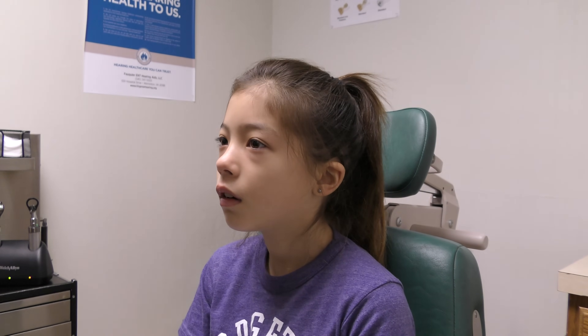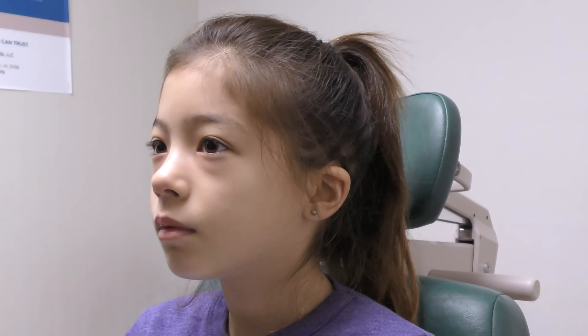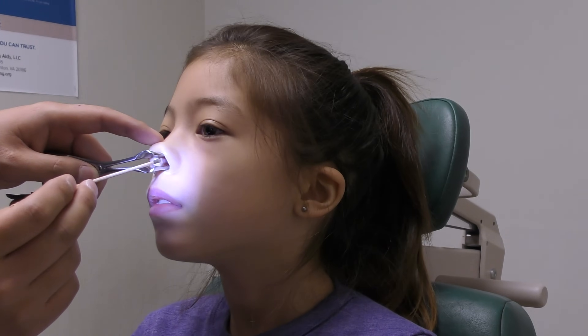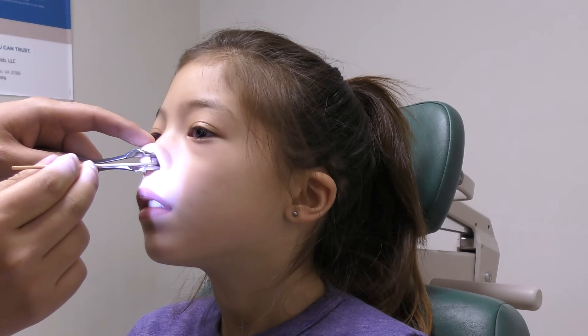A small wooden stick tipped with a chemical called silver nitrate is then applied to the area that is causing nosebleeds. With application, nitric acid is created through a chemical reaction, which then cauterizes the nasal mucosa and hopefully stops any bleeding.